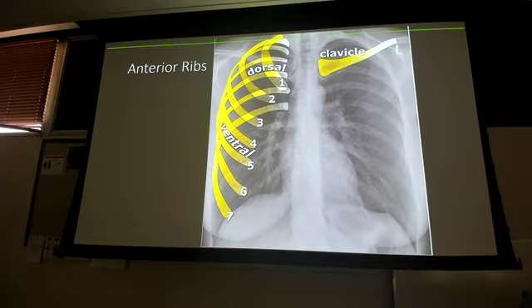So when I'm looking at anterior ribs, remember the way that the thorax is shaped and the ribs are shaped, they're going to be my more steep ribs because of the wraparound of the axillary portion. The x-ray is done this way. Sorry, I'm turning my back on you, but the x-ray is done this way, posterior to anterior. So my posterior ribs are more horizontal, but then it wraps around. It's a game of shadows. And then on top of that, the anterior ribs come around and come up towards that sternum, right? So you end up having this steep kind of shape on these anterior ribs.